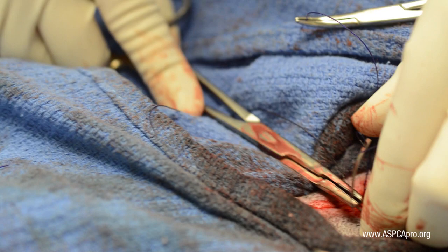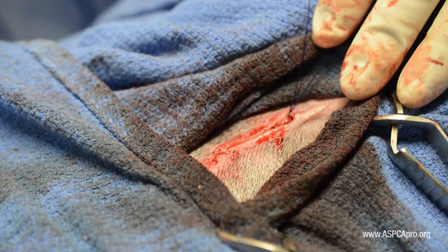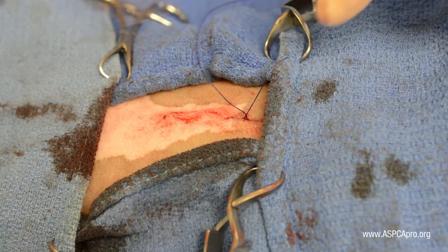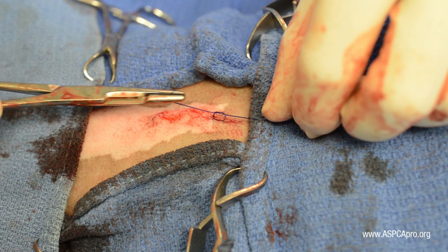The very last bite of dermis should exit in the subcutaneous tissue rather than the dermis itself, and then be tied off to the free end of suture being held by hemostats. Four to five throws are adequate to complete your closure, being careful to make sure each knot lies on top of the one before it, without including fat into the knot.